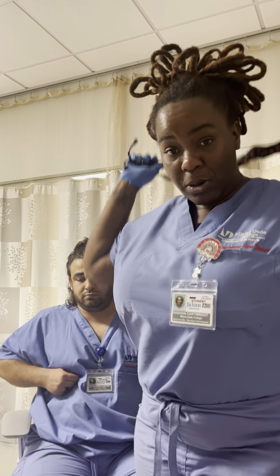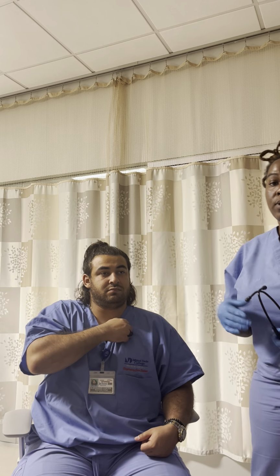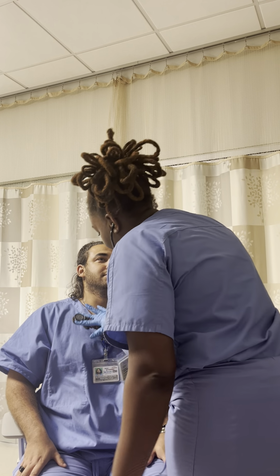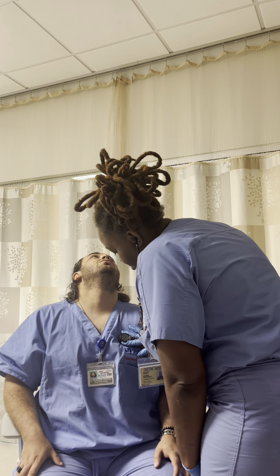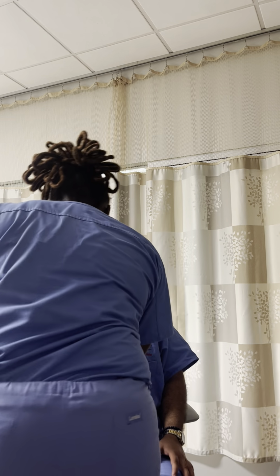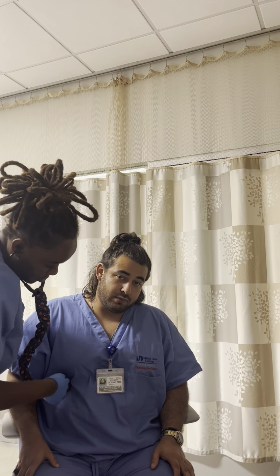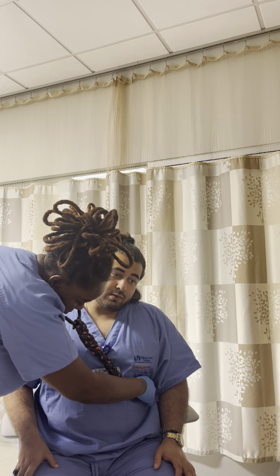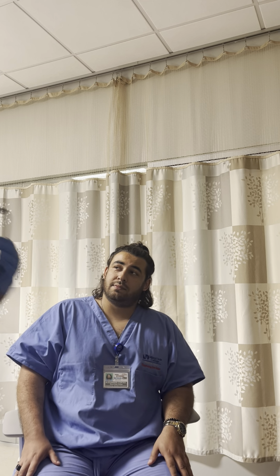Going to assess your patient's heart rate, respiratory rate, SpO2, blood pressure, temperature, and most importantly, breath sounds. All right, great. We assessed the patient's breath sounds.